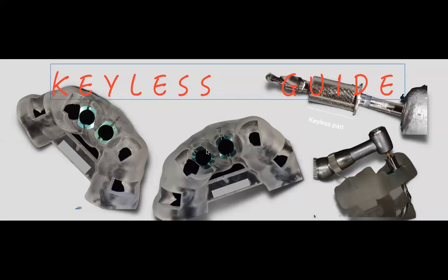okay? That means you have an ability to change your mind if you wish, whether you want to go with a thinner implant if you see there's a mistake, a longer implant if you feel that you want, or a shorter implant, either or. You can still change your mind the day of surgery. Now, I like keyless because it eliminates another part in the patient's mouth.